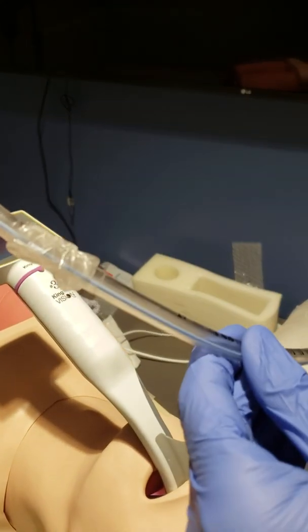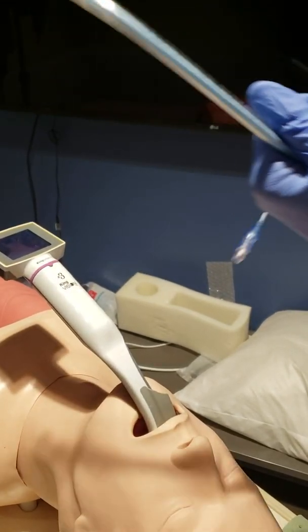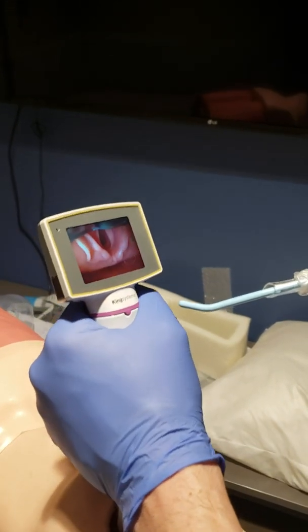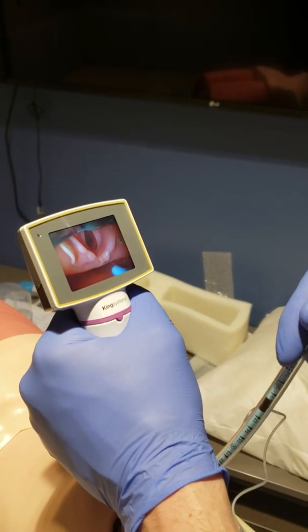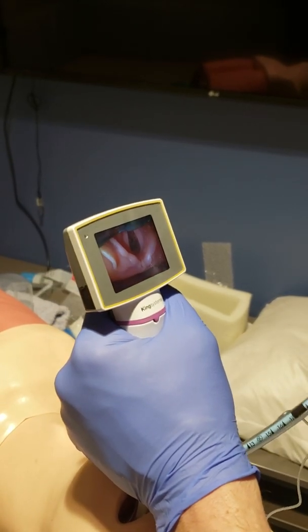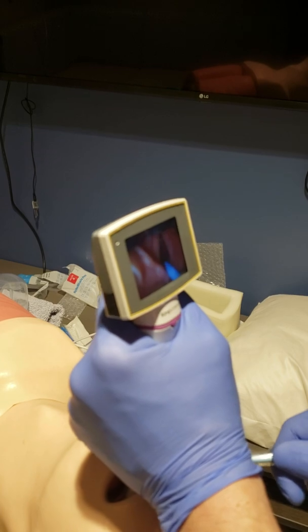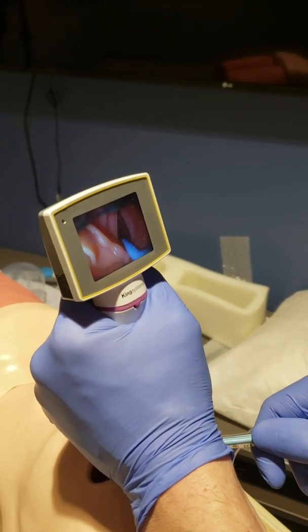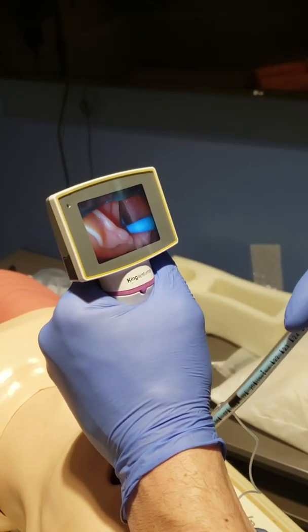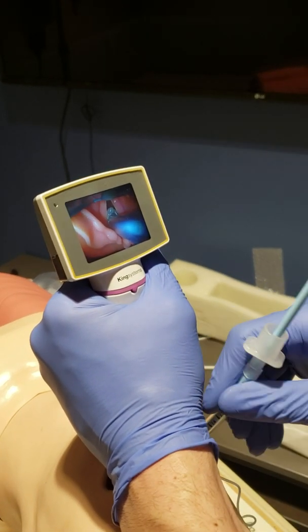So I come back out with my ET tube, and that's why I put in the bougie — because you have that little lip up. Now I've got my vision again, and I'm coming down, making sure that my bougie tip is up. Since it's tipped up, I have a little more leeway to play around with it and get it into the glottic opening. The nice part about this King Vision is that I leave it in when I get the bougie in, and I can slide the ET tube in while the King Vision system is still in, watching it go in.